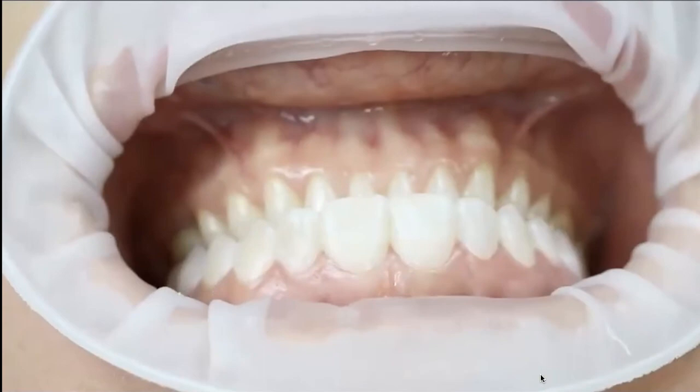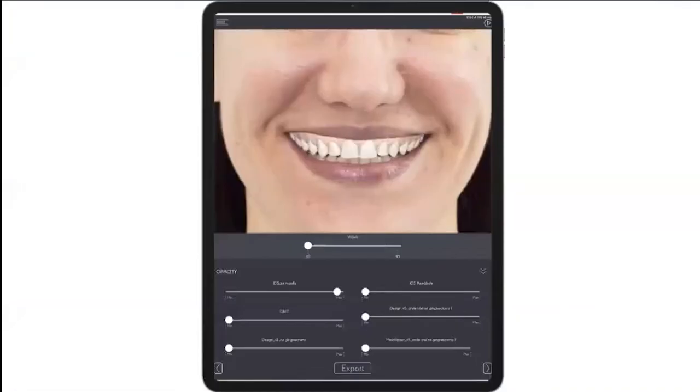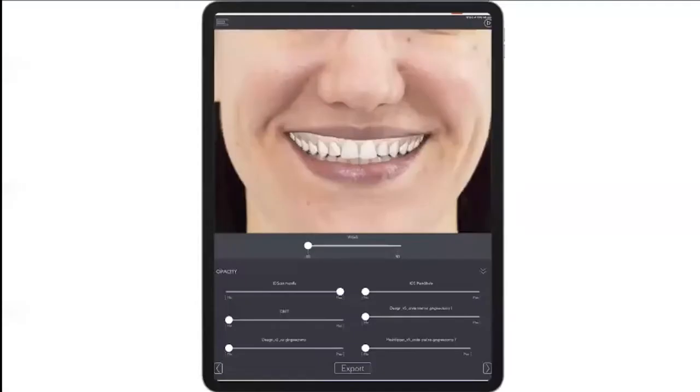And this is something that you as a dentist don't have to do. You can ask your dental assistant to create that. Then take some pictures, take some videos for the patient to test it and have the full experience on what type of work that they would like to receive.